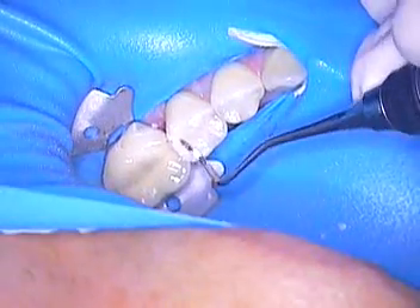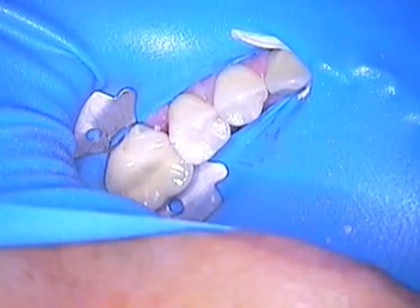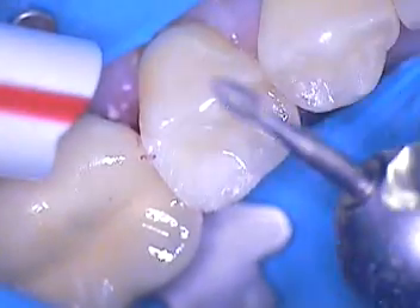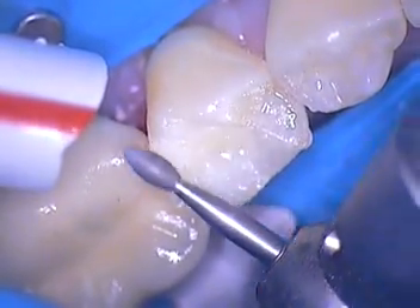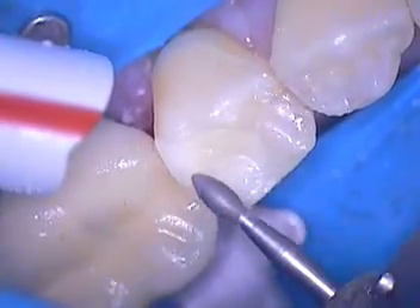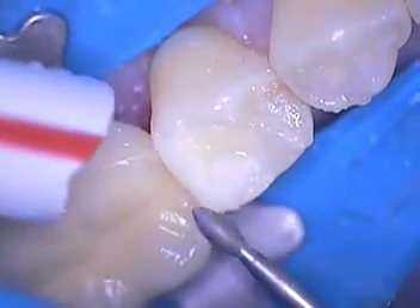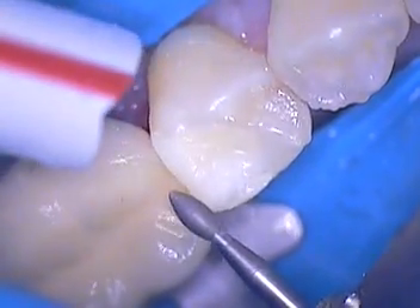Contours look great, but we've got this occlusion to concern ourselves with. The first thing I'm going to use is a fine football diamond, and I'll just trace out my marginal ridge and go ahead and burnish it down. I like to try to keep the marginal ridge rolling versus a flat marginal ridge.